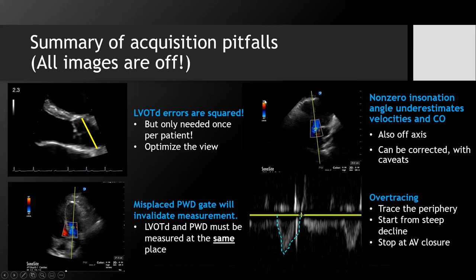So usually this is not what's going to clinch getting a nice clean blue outflow. Not everyone says the blue outflow is the most important thing to do, and there are issues with color in that you could be misunderstanding what the color is showing, or if you're off axis, that's why you're not getting the right color flow.